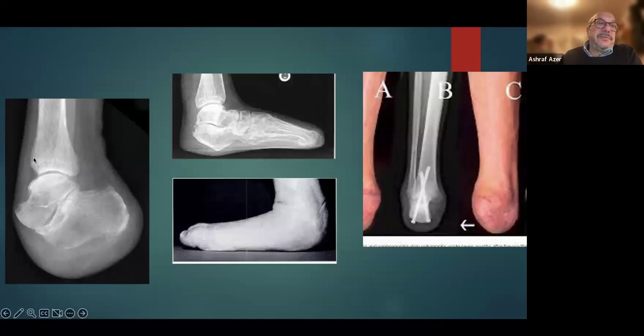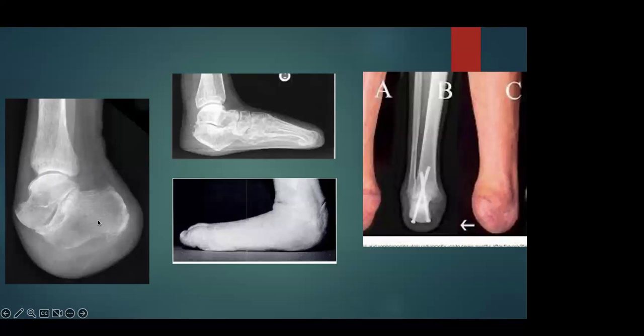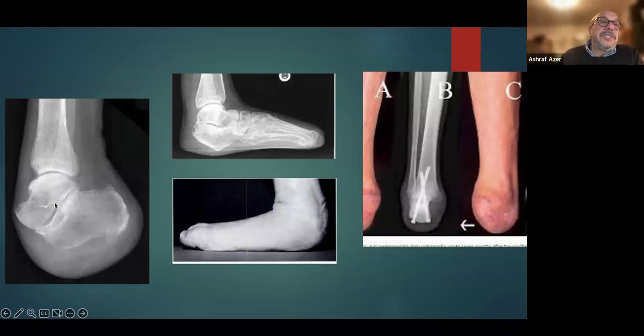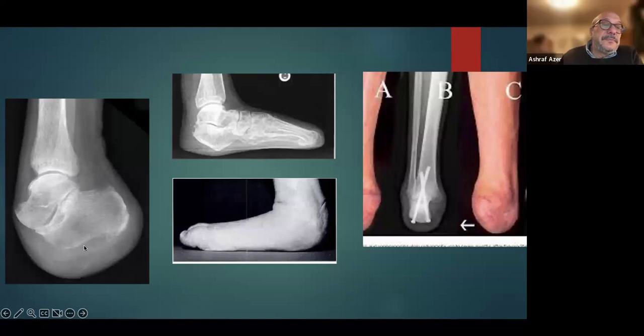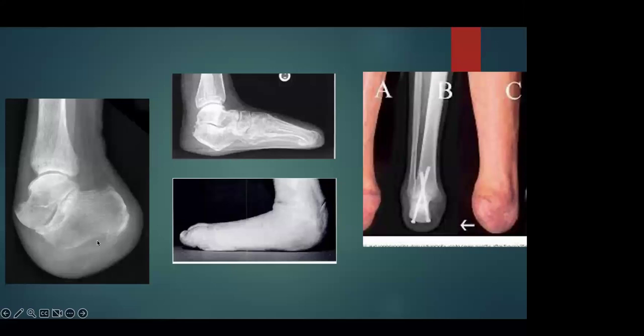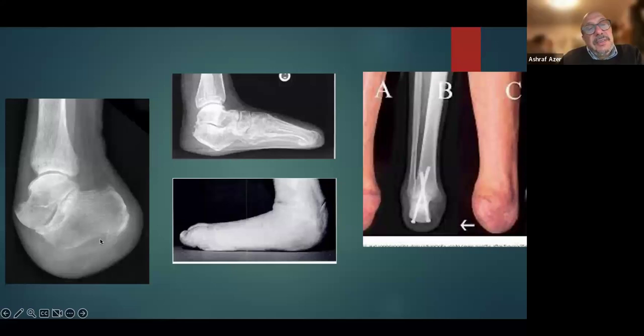And what is this now? What you call this is very... Chopart. Absolutely. Chopart. So Chopart, what will happen here? What is left? Talus and the calcaneus. It will go into plantar flexion right away. And what will happen here in a diabetic person? Pressure sore. Straight. Can he walk after that?